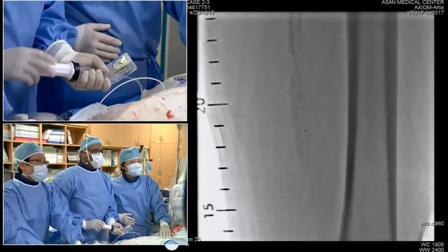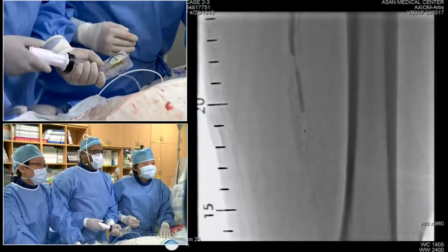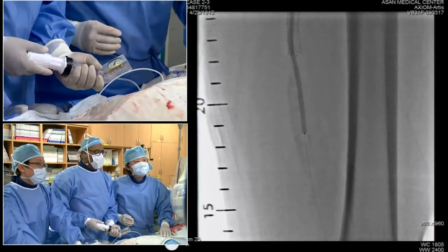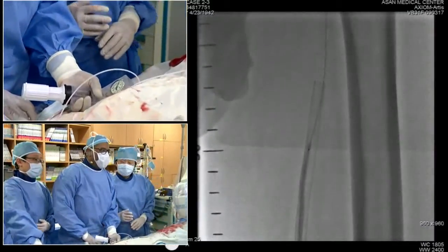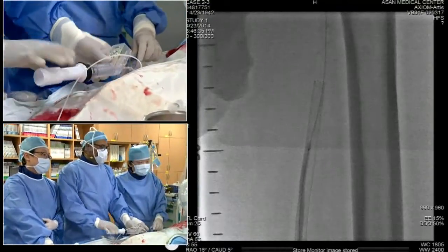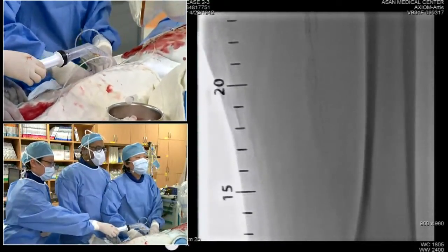So let's take a look. What we want to do is see a waist on this balloon to define our re-entry point. And that's the stenosis coming out of the distal stent. And I don't see the waist that we typically see when we re-enter the true lumen. So at this point, let me just see further up. Okay. Good job. Does that mean we have to go a little further down? We have to go further down, but the issue now becomes that we have a winged balloon that we're trying to push further. But clearly with excellent skills, we can do that.